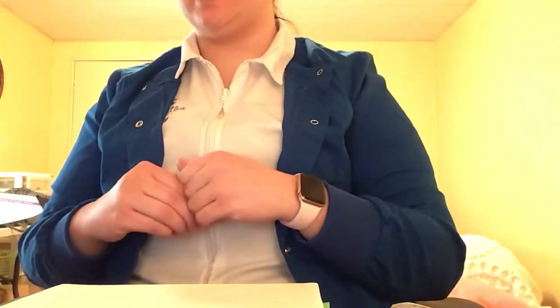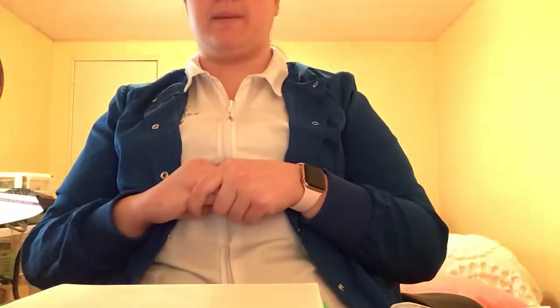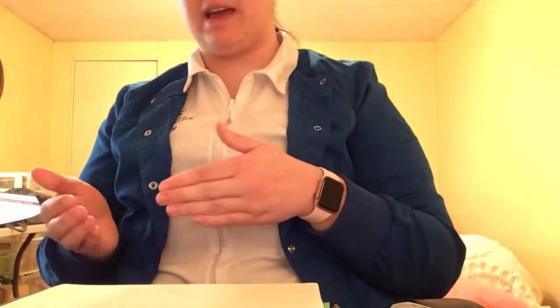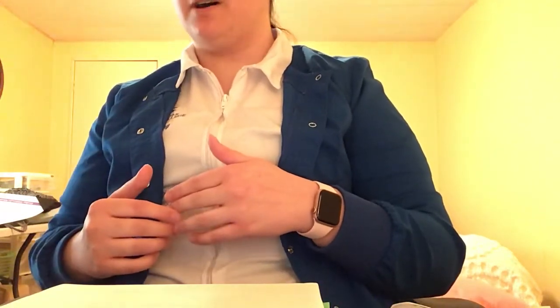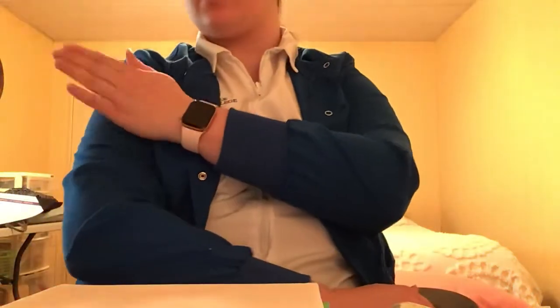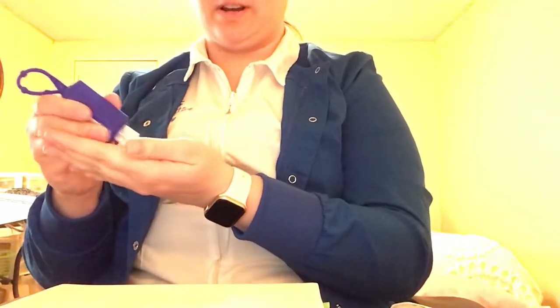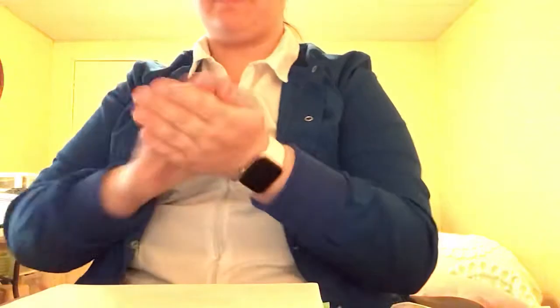So then I would go ahead and let her know that I need her to sit up on the side of the bed and relax her arm as much as possible. I would ask her which one is her dominant and non-dominant, because I want to give it in her non-dominant hand to prevent any extra soreness or irritation. And so she would say that she is left-handed, so I would go ahead and give it in her right arm. So I'm going to go ahead and sanitize my hands one more time before I start, and I'm going to don my gloves.